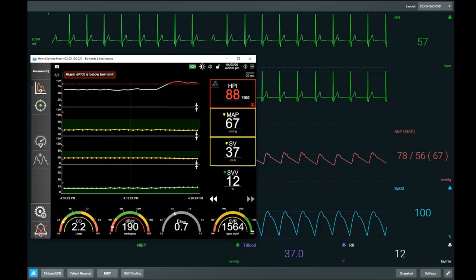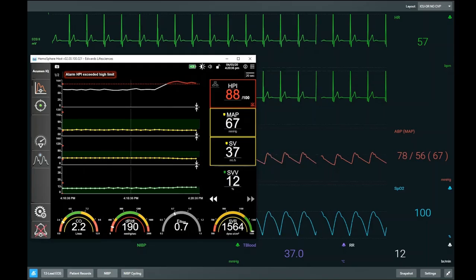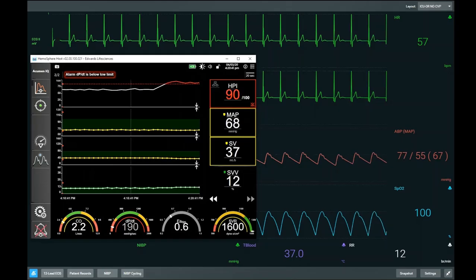The gradient of that line is called end systolic elastance, and that's what we use to quantify physiologically, or to truly define, what our LV contractility is. Now, to think that something measured at a peripheral arterial waveform represents what's going on at the ventricle is quite a large assumption to make.